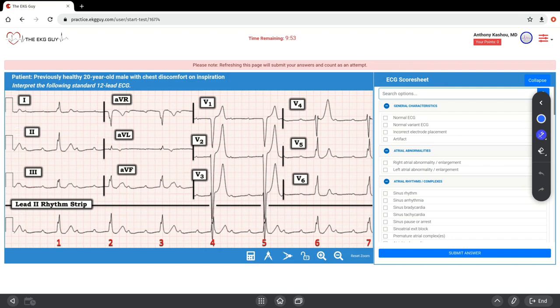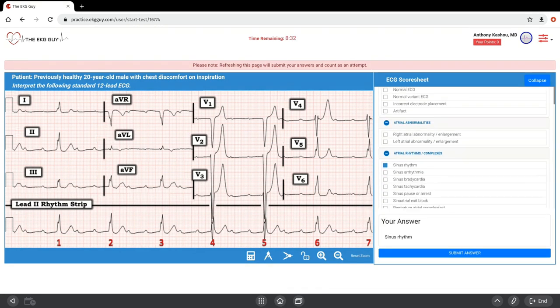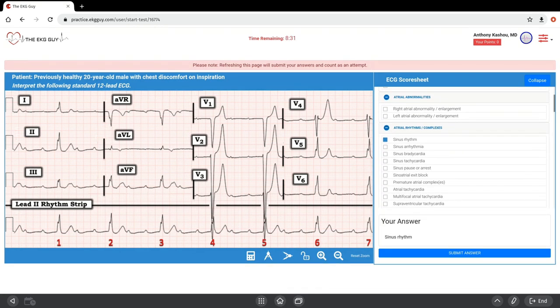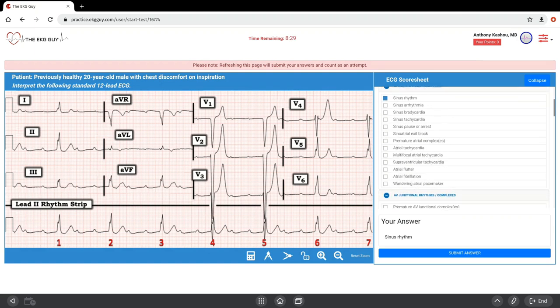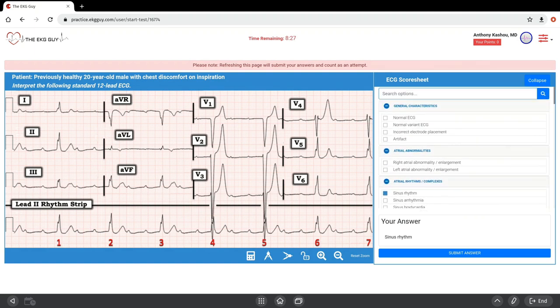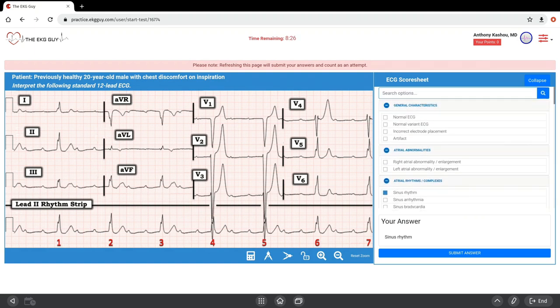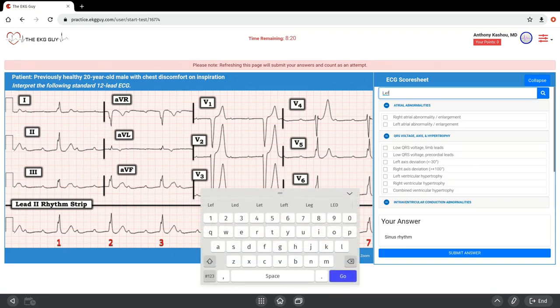You can simply search the options or any labels here. You might click some of these labels, for instance, sinus rhythm, and your answer shows up. You'll want to complete your full interpretation. If you're looking for any option, search it here. For example, if looking for left atrial abnormality or enlargement, you'd click that.